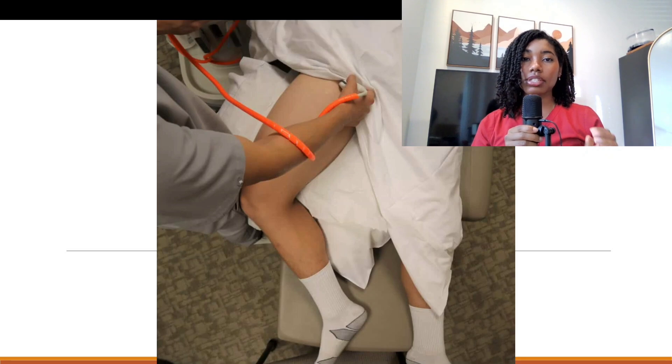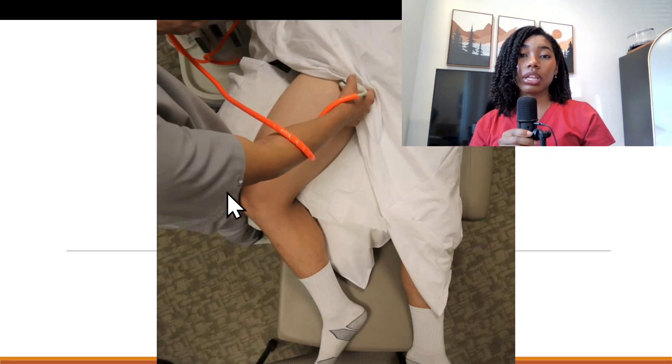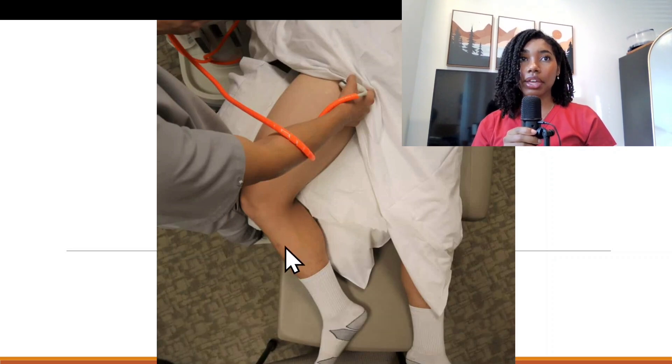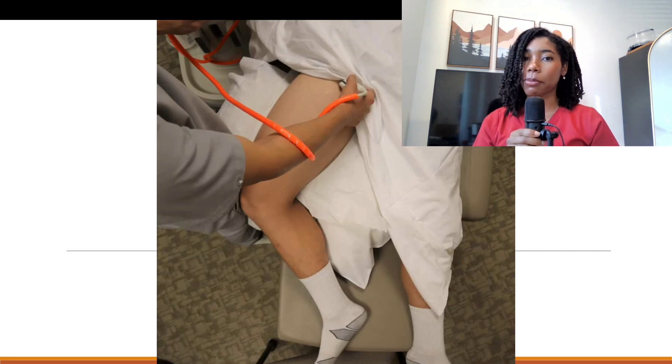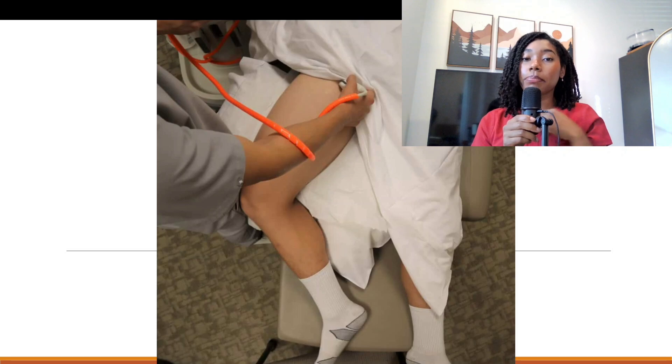First, ensure that the patient is in the proper position. For lower extremity arterial exams, it would be best for the patient to be in a frog leg position with the knee externally rotated, as you see here. One sure way to make your exam harder than it needs to be is to not have the patient in the proper position, so definitely do not skip that.